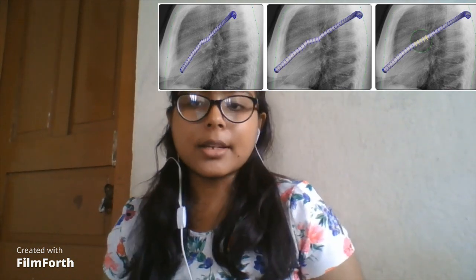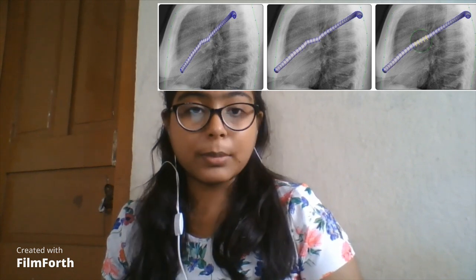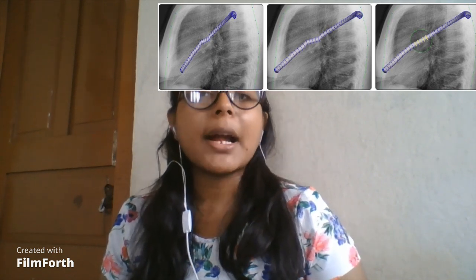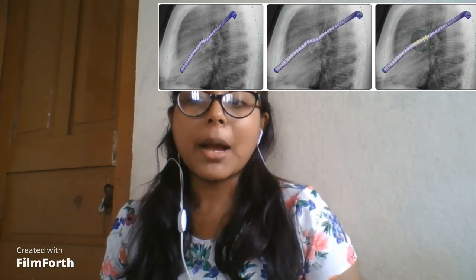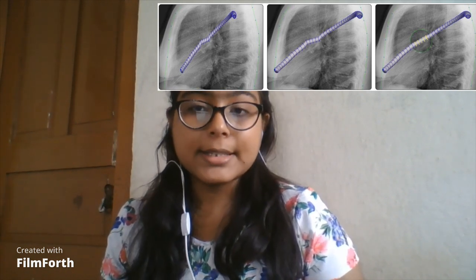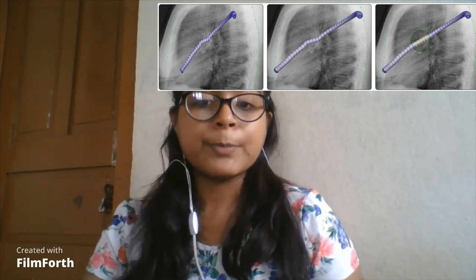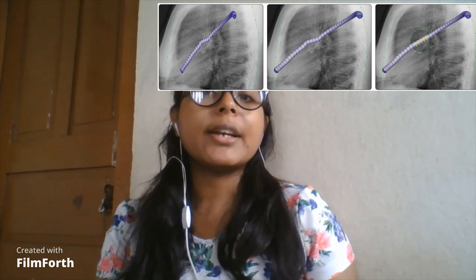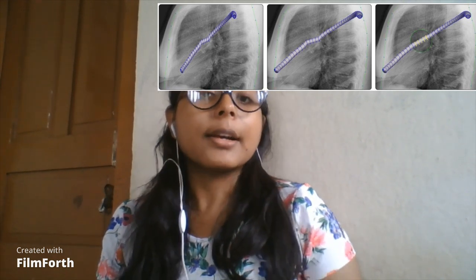To classify the subclusters, an algorithm starts by finding the vertices in each subcluster with the maximum and the minimum y coordinate values. The subclusters whose maximum and minimum y coordinates are not within the experimentally determined threshold value of the border of the 3D model when it is projected onto the xy plane are assigned to the lateral vertex cluster.